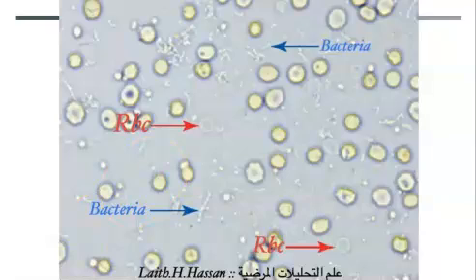One other thing I want to mention for comparison of the red blood cells versus the white blood cell: the red blood cells are smaller in size than the white blood cell.